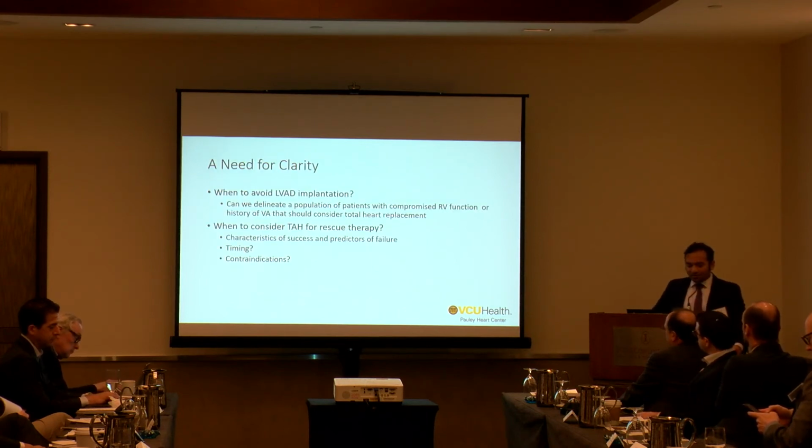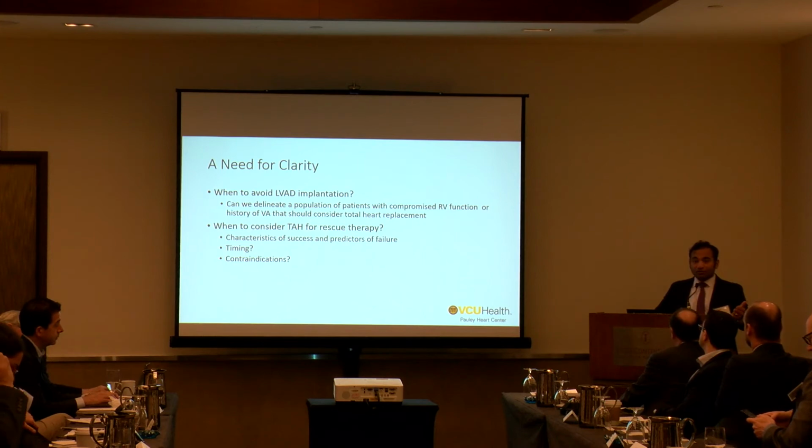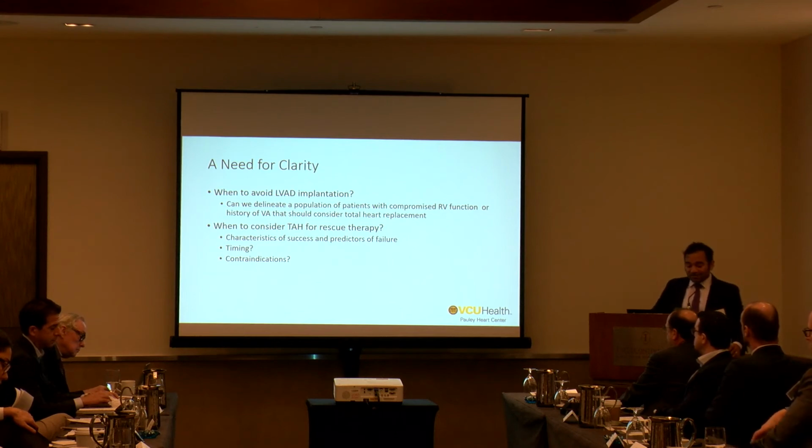So to summarize my thoughts on the topic, based on our experience, the device is very effective for salvaging someone who's failing on LVAD therapy. And I think the two primary indications where we'll think about it are in patients who have ventricular arrhythmias on device, where the arrhythmias are associated with some decompensation or suboptimal VAD support, and those people with persistent RV dysfunction. It seems like at least the events are occurring very early after LVAD implant, and those are fairly successful cases to salvage.